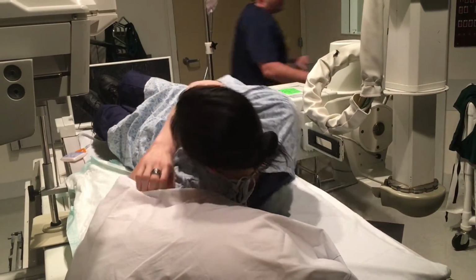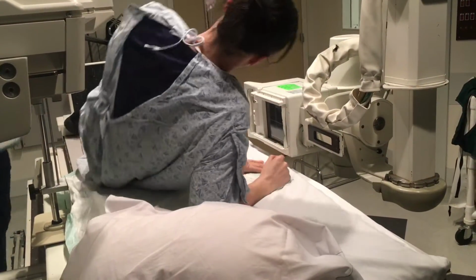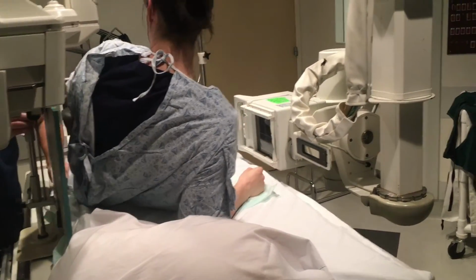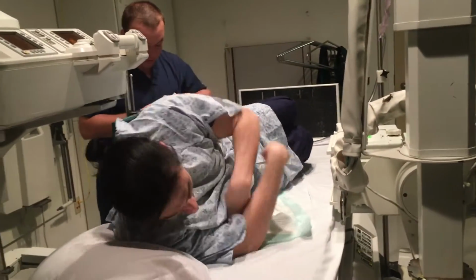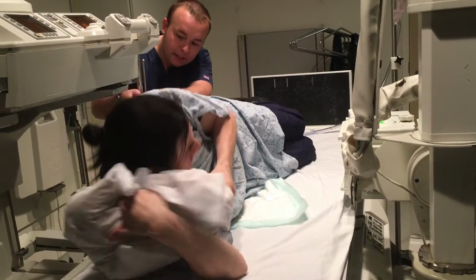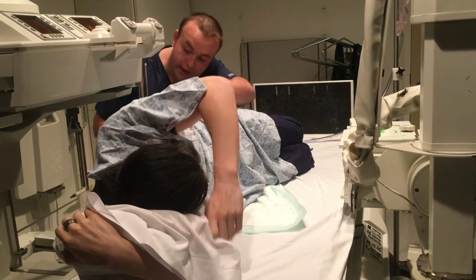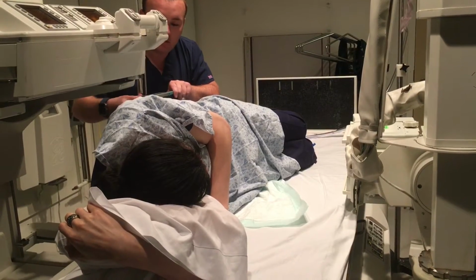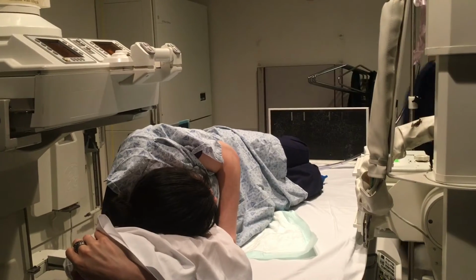We're going to use another grid. Yeah. Oh. We'll get that cleaned up. It's alright. Should be wearing gloves for this. But, so this is the right decub, iliac crest, mid-sagittal. Left marker is pointing up, his left side's up, right side's down.